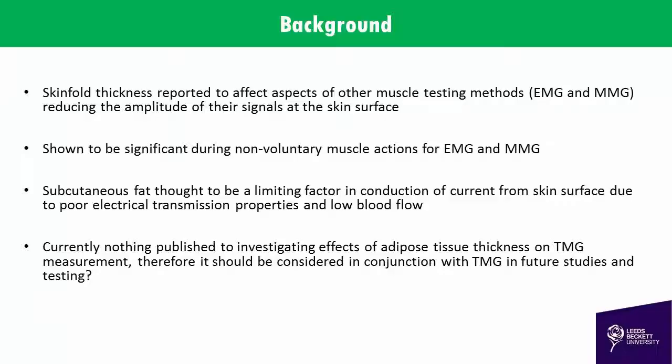A bit of background on some of the other relevant areas. It has been reported that skin fold thickness in relation to other types of muscle measurement has been shown to have an effect. Both EMG and MMG have had studies published that have shown this, and also relevant to TMG, significant in non-voluntary muscle contraction as well. So obviously that's what we're looking at with TMG.